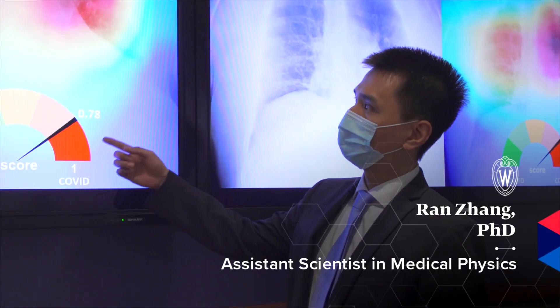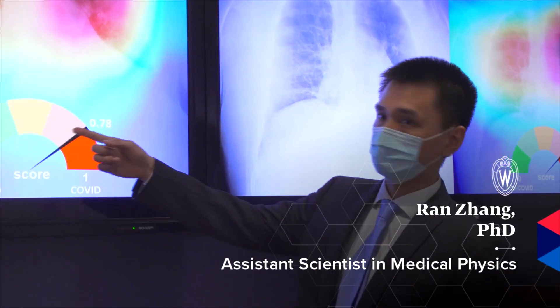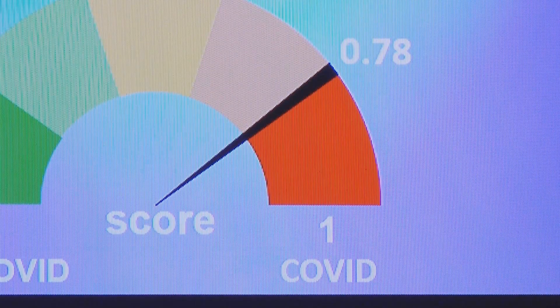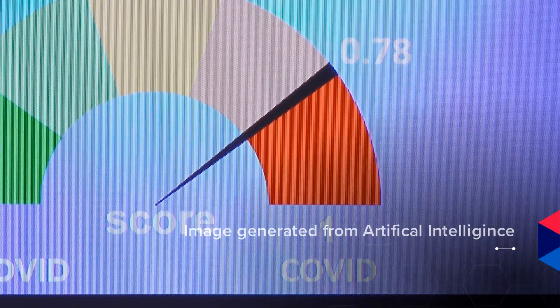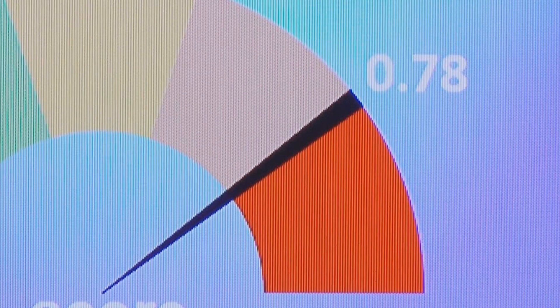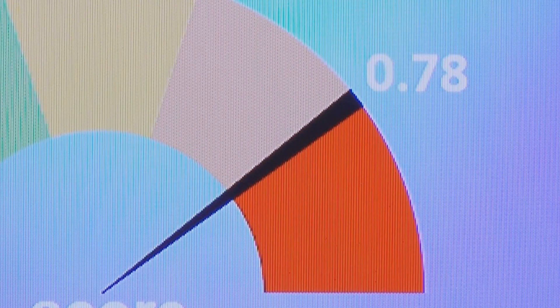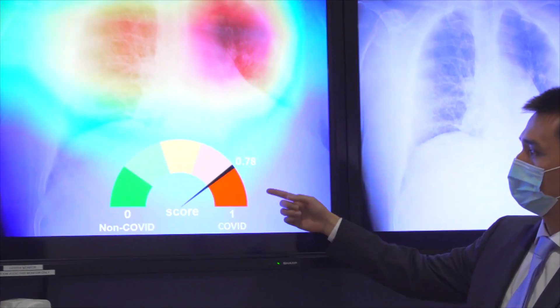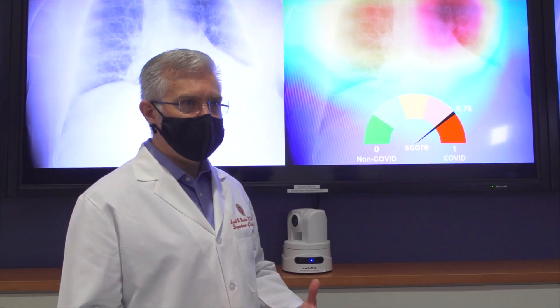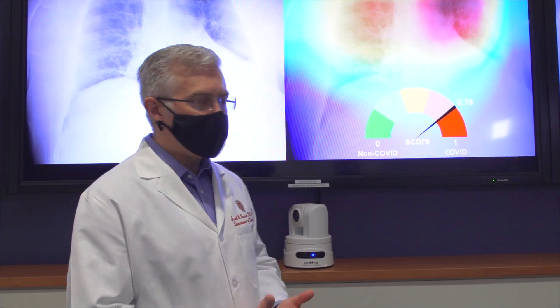Our algorithm reads the chest X-ray image and it gets two things. First is a score between zero and one, with one being very likely to be COVID. In this case the score is 0.78, which means it's very likely to be COVID pneumonia. That immediately alerts me that I need to get this report done quickly.